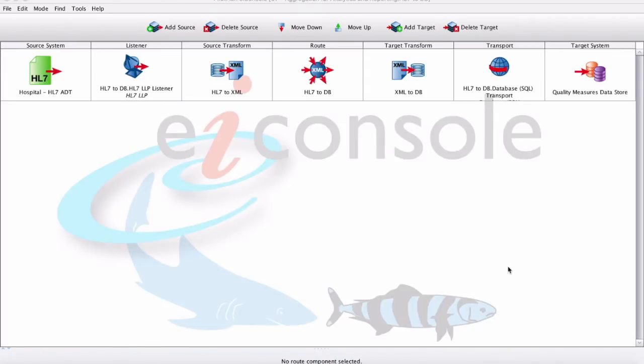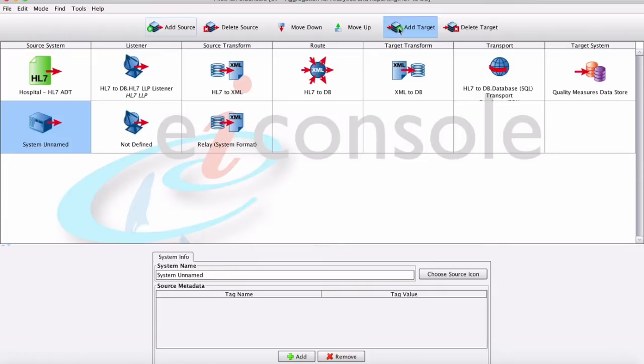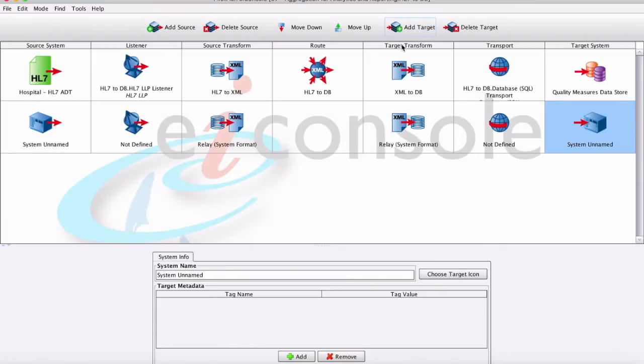Connect anything to anything with the EI console for healthcare. Define your source and target systems with a click of a button, then configure the step-by-step interface assembly line to define the mechanics of the data flow.